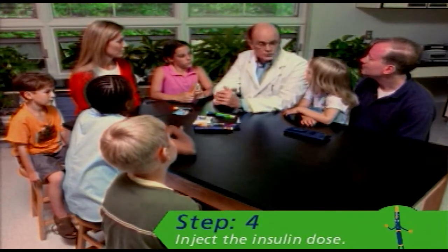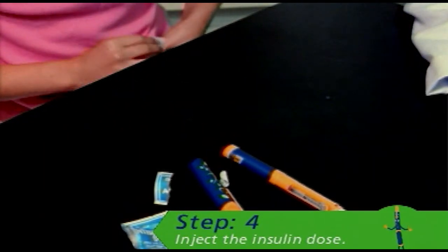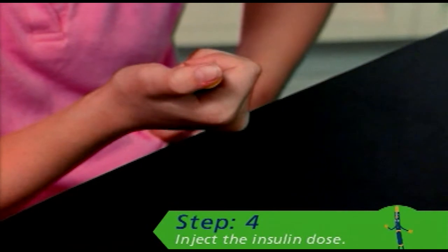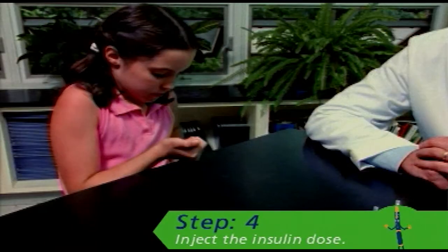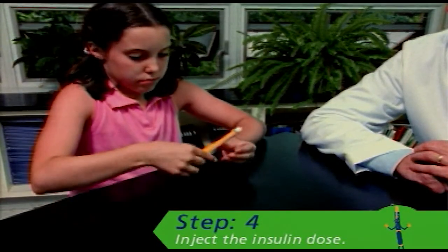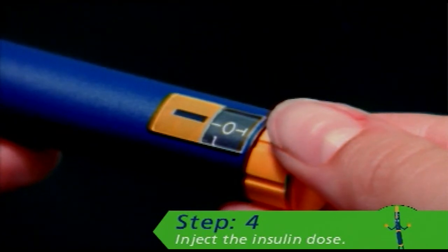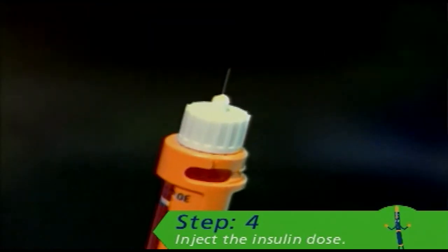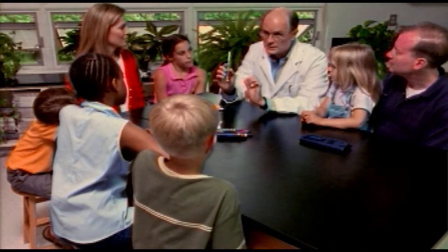But first things first — make sure you wash your hands with soap and water. Then wipe the injection site with an alcohol swab; you want this area to be clean and dry. Pinch the skin about to be injected and insert the needle using the injection technique recommended by your doctor or healthcare professional. Next, press the push button as far as it will go and hold it in the skin for six to ten seconds. Then remove the needle from the skin. Always be sure to check the dose indicator window to make sure you've injected the full dose — a zero should appear in the window if you have injected the dose correctly. Once you've finished the injection, carefully unscrew the needle and place it in a puncture-resistant container. And that's how you use your NovoPen Jr. diabetes management system.